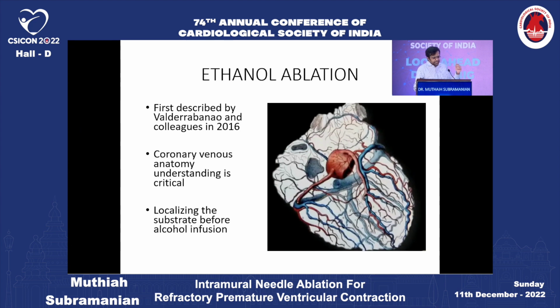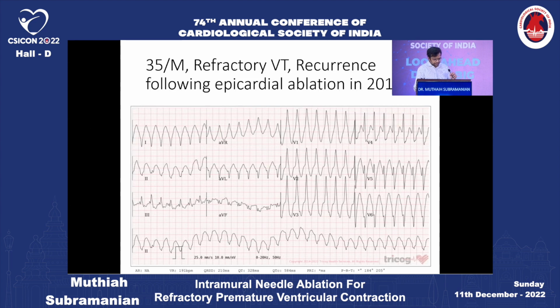This coronary ethanol ablation through the veins was first described in 2016. But it's very important to understand the venous anatomy, and before localizing where you're going to deliver the alcohol, you need to understand where the substrate is. So you need different techniques for mapping within the veins as well.